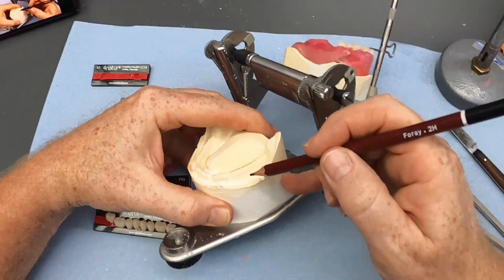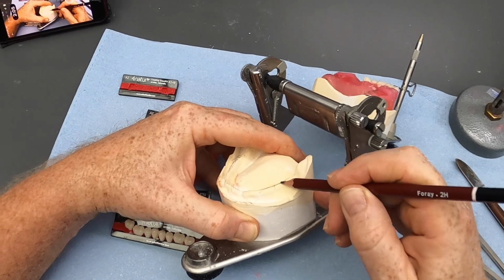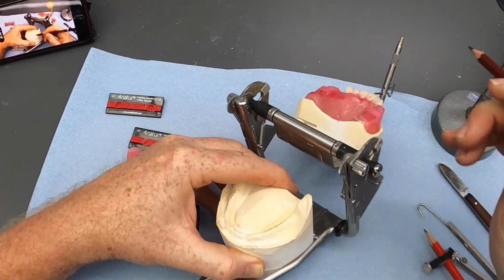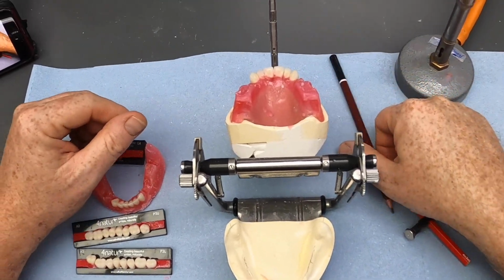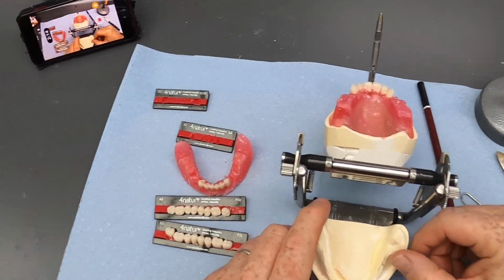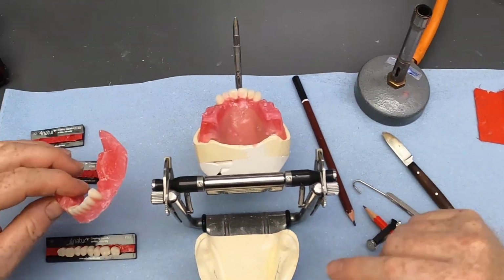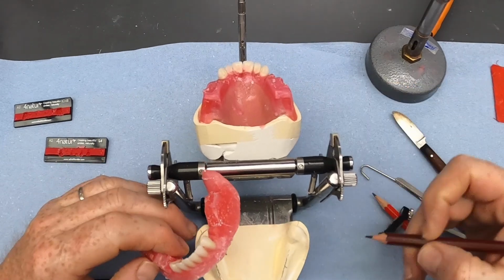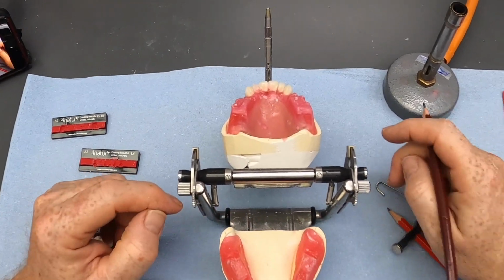And if you get into making dentures and setting teeth and where the teeth should be positioned, there's some rules about how far forward and back from this point you should go and so on, and you can read about that, or we'll discuss it in another video at a later date. But we're aiming for about this point with the central fossa of our lower six, so we can put our rim back on. I can mark the side of the model like this to give me an indication of where we want that tooth to be, and then I can go ahead and set it.